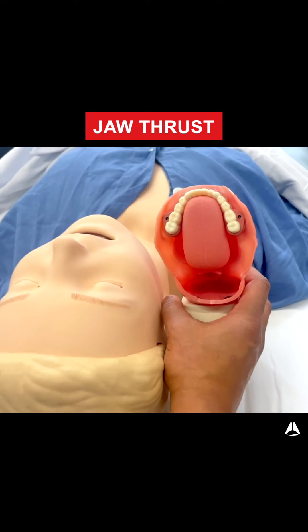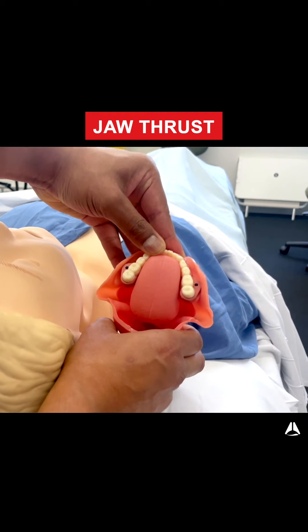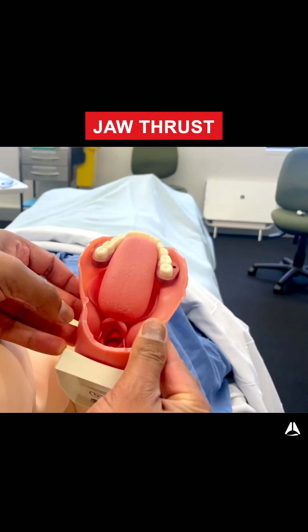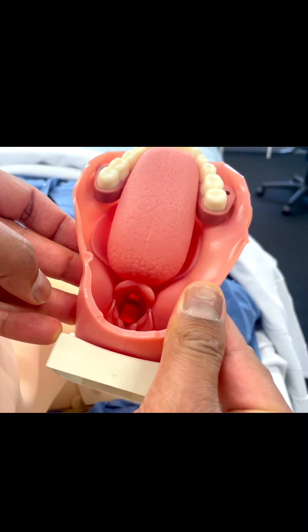Sometimes the tongue and soft tissues are so pronounced that they're blocking the airway — there's no passage of air possible. If you do a jaw thrust, you're simply lifting those features up and that allows a nice aperture and opening into the airway. It allows the flow of gas and flow of oxygen.